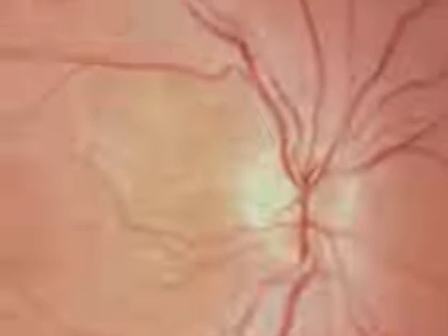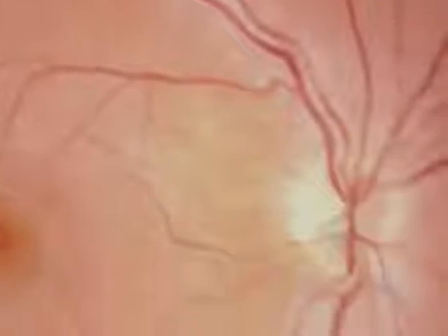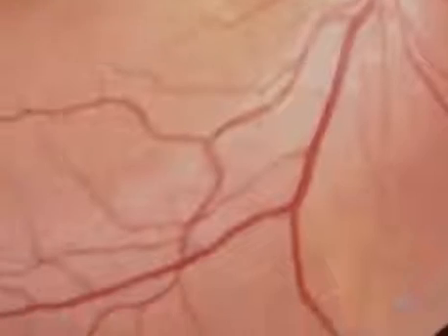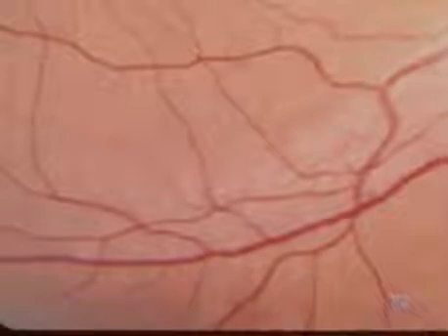Having examined the disc, go on to look at the major blood vessels as they radiate out from it and form the four vascular arcades that supply the quadrants of the fundus. You can readily bring each area into view by asking the patient to look towards the quadrant you want to examine — for example, looking up to the right brings the upper right quadrant into view. In order to examine both lower quadrants, the lid has to be lifted up as the patient looks down.